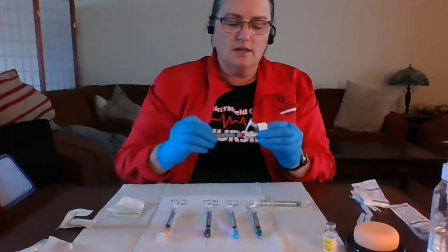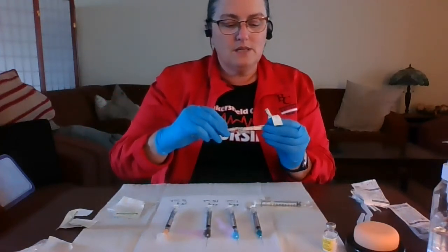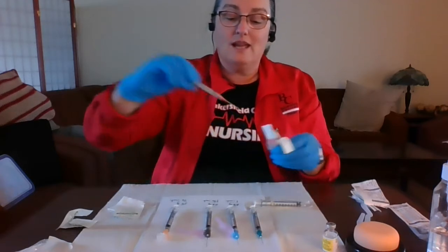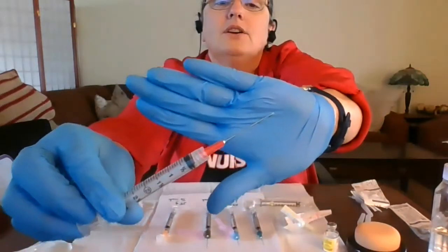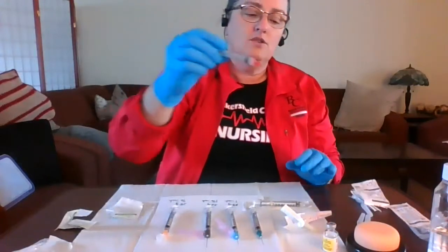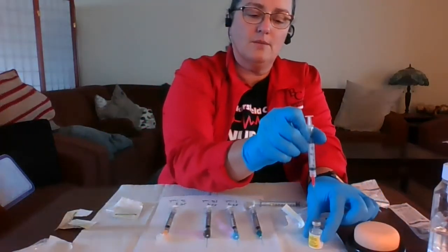So this draw needle, let's see if it tells me the size. They call it a blunt sometimes, and this is an 18 gauge. So an 18 gauge is a large sized needle. I'll show you. You can see that here. And this is again meant to insert into the vial and draw the medication out.